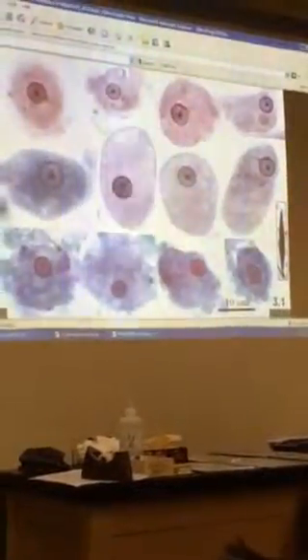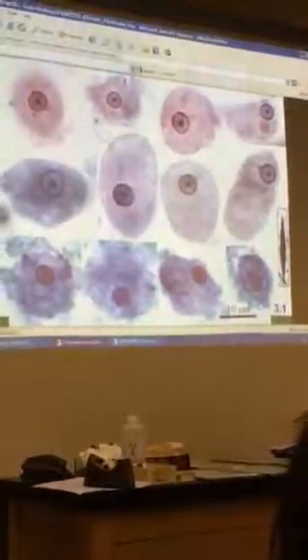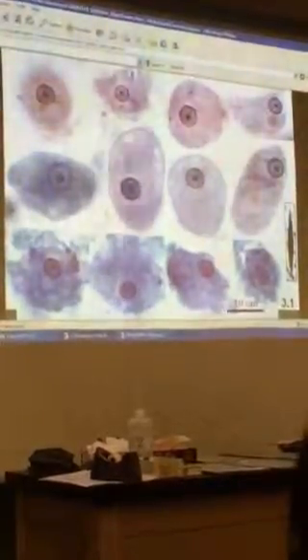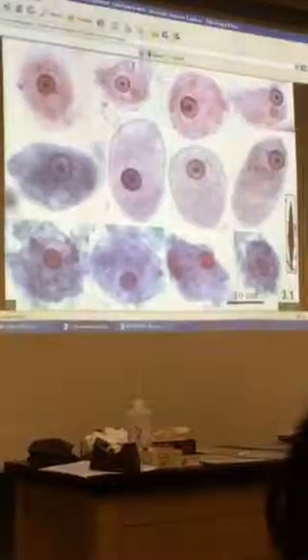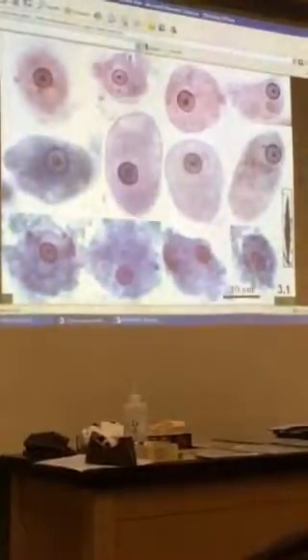Okay. The cytoplasm of E. histolytica is finely granular, non-vacuolated, and sometimes they can have red blood cells. Ingested RBCs are diagnostic. E. histolytica is the pathogenic one. When it becomes virulent, it causes damage to the intestinal mucosa, which will induce bleeding, and it feeds on the contents of those cells. It's digesting the intestinal cells and damaging them.